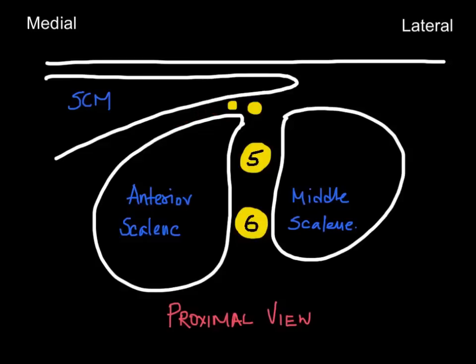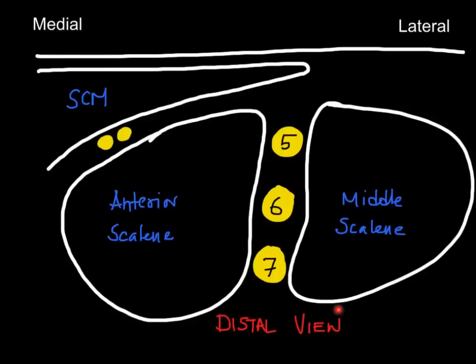As you move the probe distally, the phrenic nerve moves medially over the anterior scalene muscle. In this distal representative view again, we can see that the phrenic nerve has moved away immediately over the boundary of the anterior scalene muscle and hence lies away from the brachial plexus. This is what is important to understand.